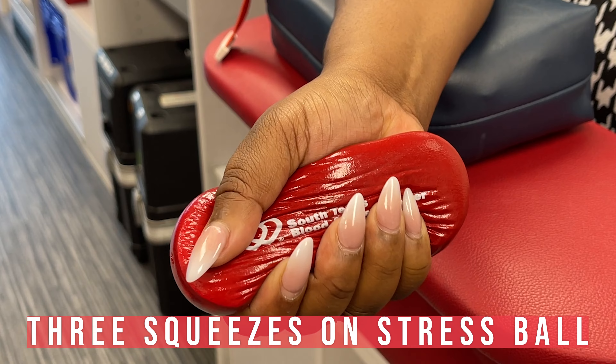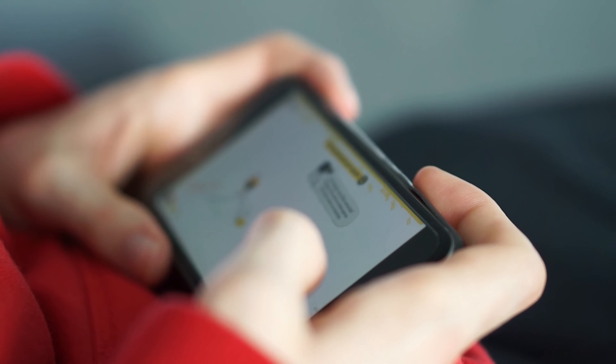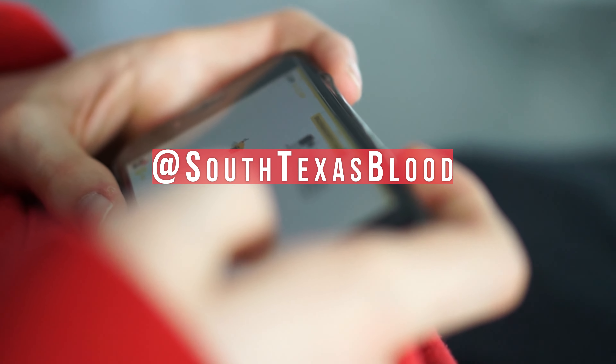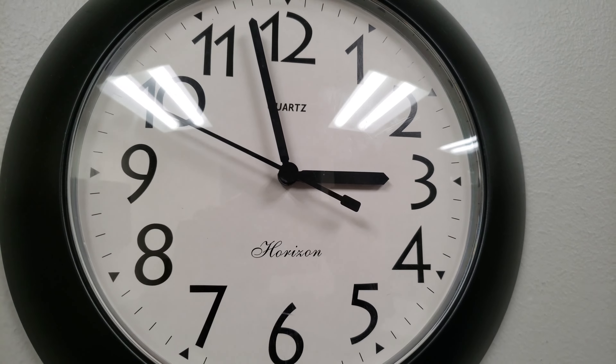During your blood donation, you are welcome to relax, read a book, play some games on your phone, or follow us on social media at South Texas Blood and Tissue. You'll be done in approximately 15 to 25 minutes.